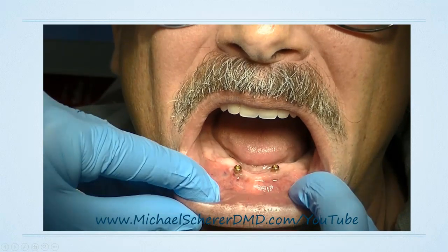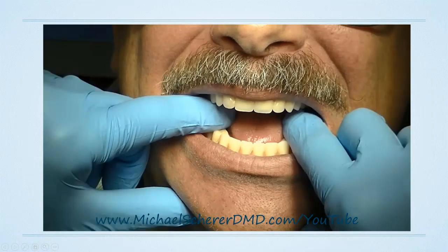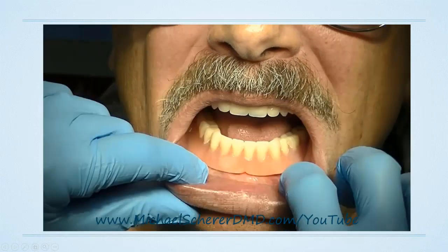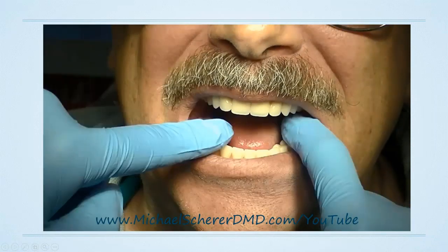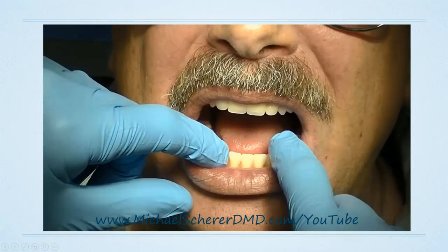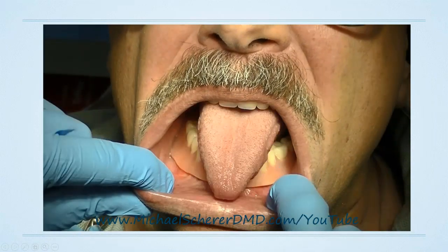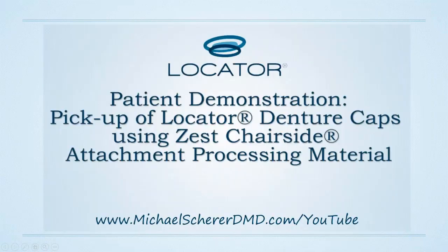Until proven otherwise, approximately 90 to 92% of my overdentures are retained using the blue insert. The other about 5 to 6% is the pink insert. And then the last few percentage points are a mixture of the clear or the extended range male inserts. If you find yourself going to the clear a lot more often for your cases, it's important that you check out your technique. Notice there that I was testing the retentiveness of the patient's denture.